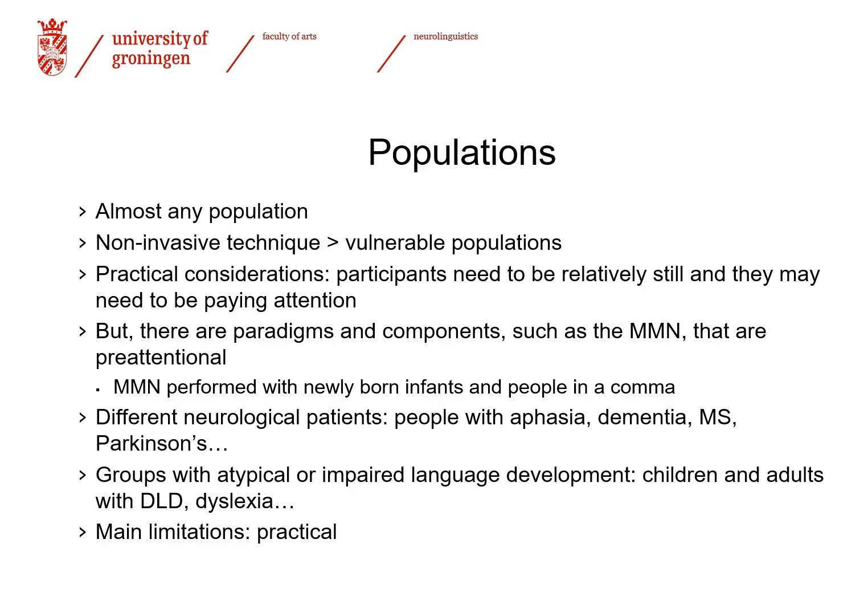During the experiment, the participants should be as still as possible because any kind of movement may introduce artifacts and essentially prevent us from gaining any meaningful data from the signal. In addition to that, depending on what exactly we are studying, our participants may need to be doing something consciously. You can think of, for example, testing 5-year-olds on a 45-minute long experiment. That may not really work out, not because of EEG, but because they simply cannot focus for 45 minutes without a break, even with breaks, I would guess.